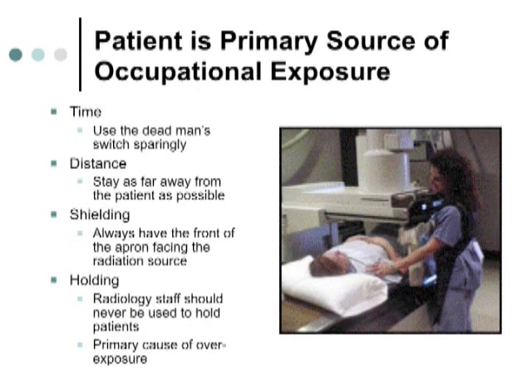So keep your time to a minimum. With fluoroscopy, the dose is directly proportional to the time that you're stepping on that pedal. The mA is pretty much fixed. You've got your kVp. It's the time that's the variable, or the number of frames that you're exposing if you're doing a cine run or something like that.